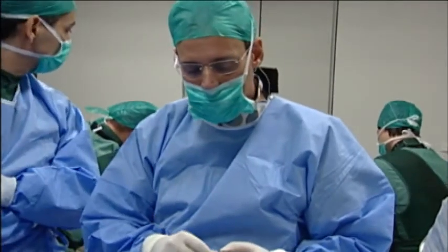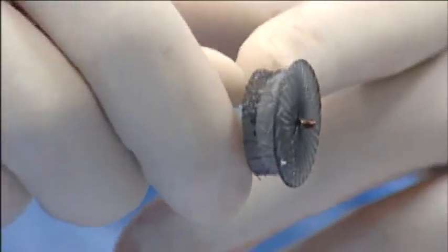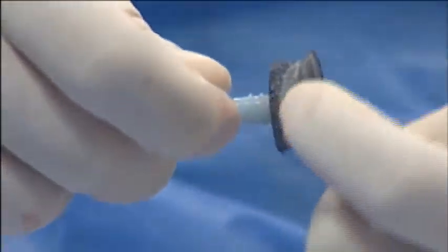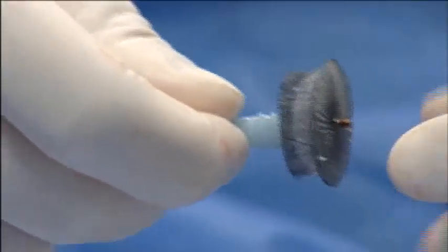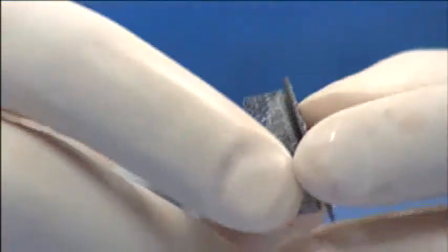Okay, so let me show you the ACP, okay? The ACP consists of a lobe that is going to be in the landing zone inside the left atrial appendage. It has some anchoring hooks here. You can barely see them, right? And the lobe is connected to the sealing disc by a very small, about 3 millimeters waist, and it does have some pivoting capabilities here. And this is the disc that's going to cover the mouth of the left atrial appendage.